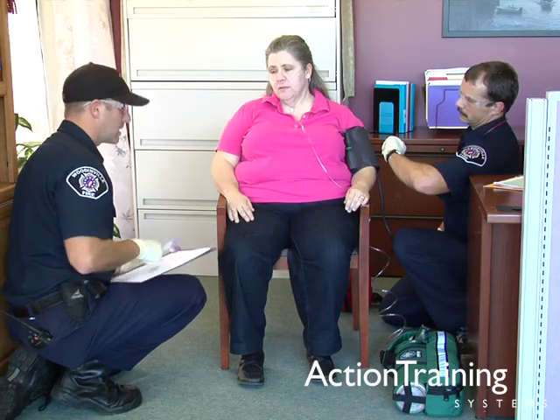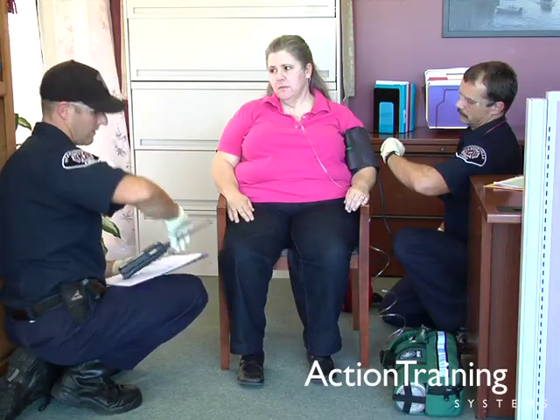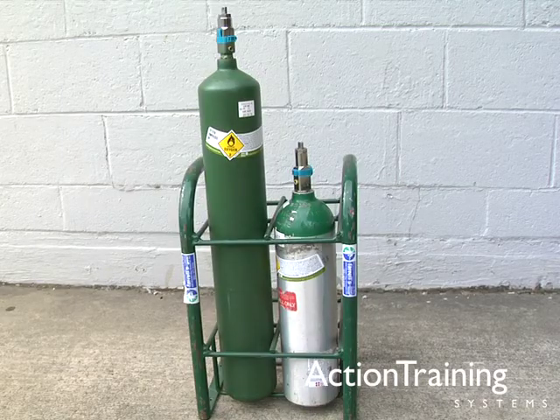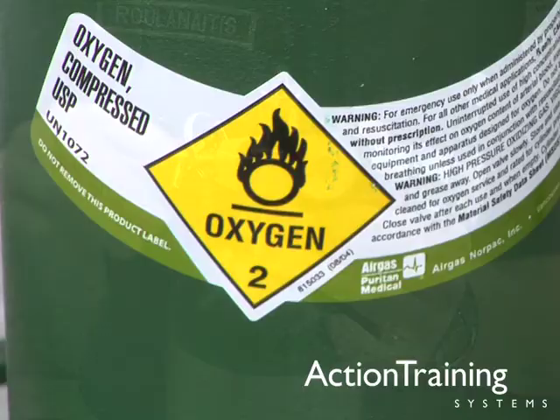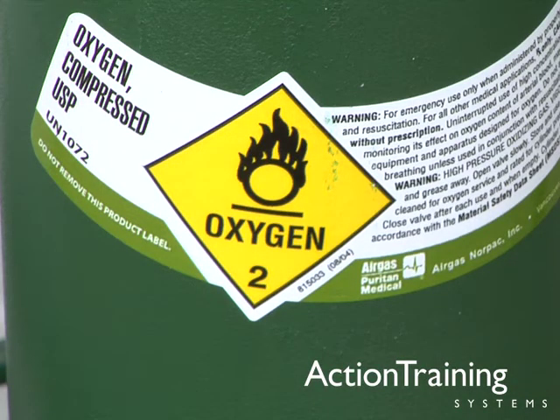In this program, you have seen how to assess whether a patient is breathing adequately or inadequately. You have seen two kinds of portable medical oxygen cylinders and how to assemble them. You have seen how to employ important safety practices when working with portable oxygen cylinders.